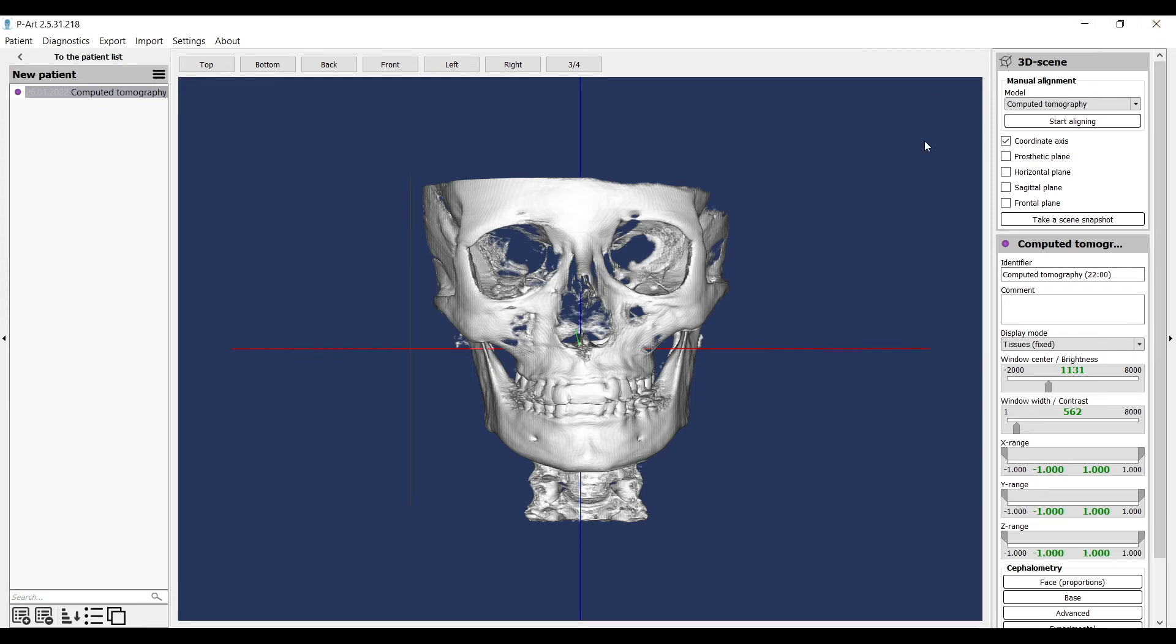To align it, we again look at the right top part of the menu: 3D Scene, Manual Alignment, choose Computed Tomography, and Start Alignment.